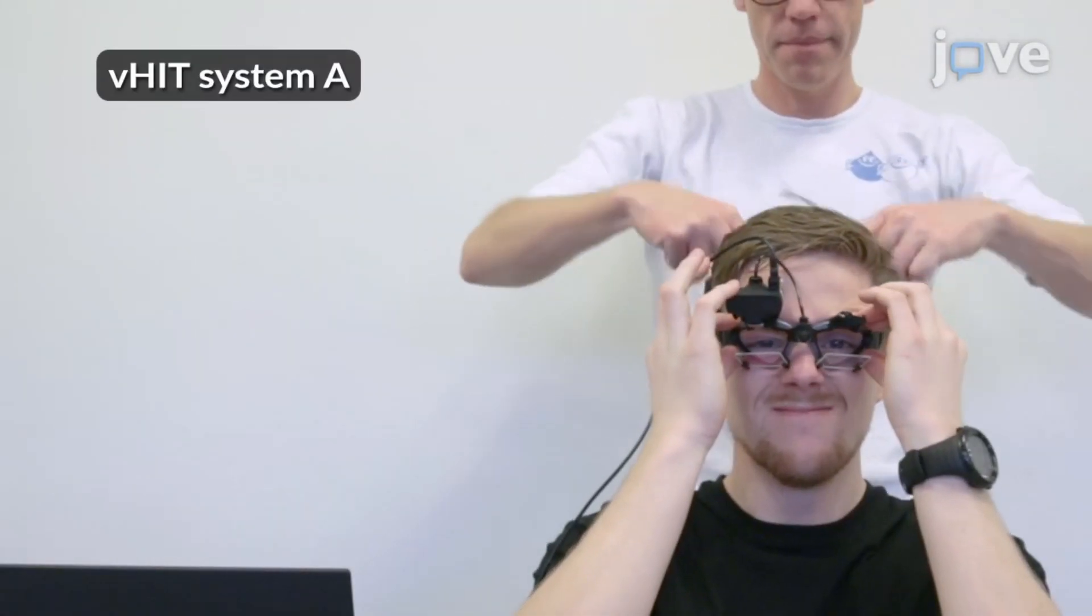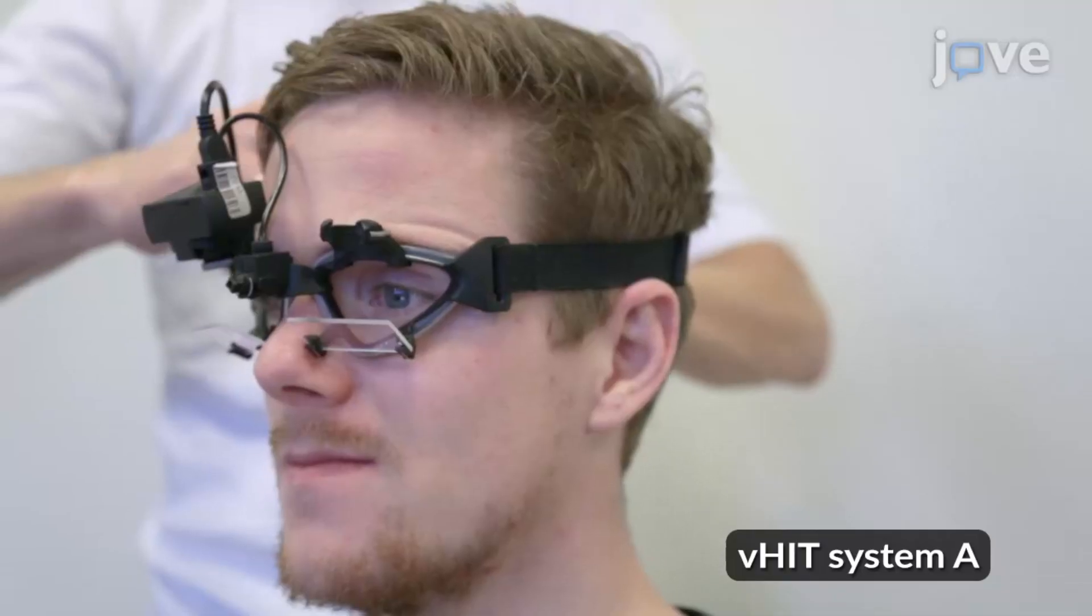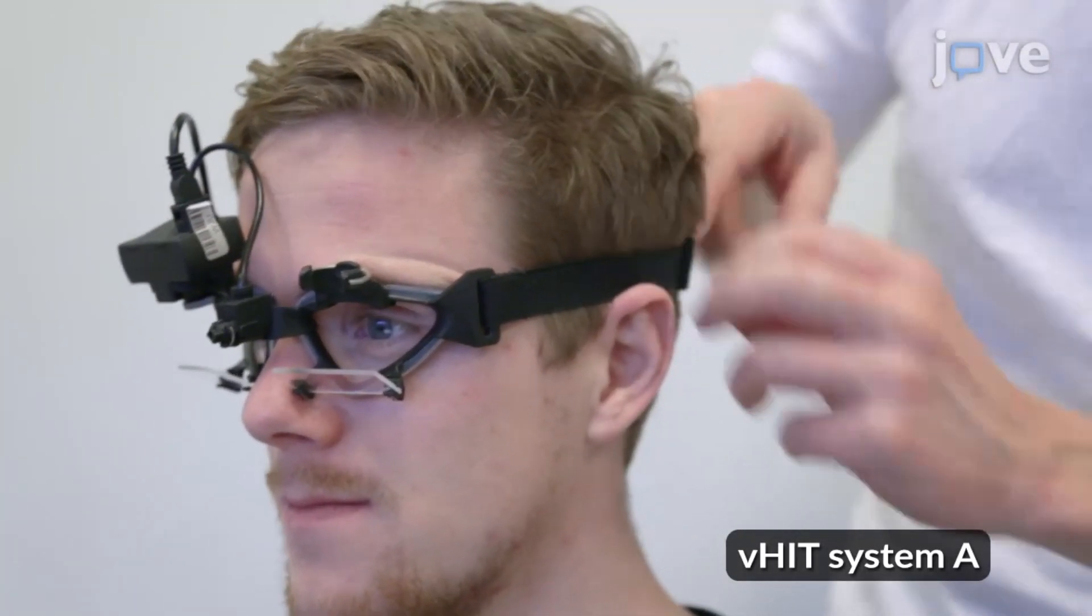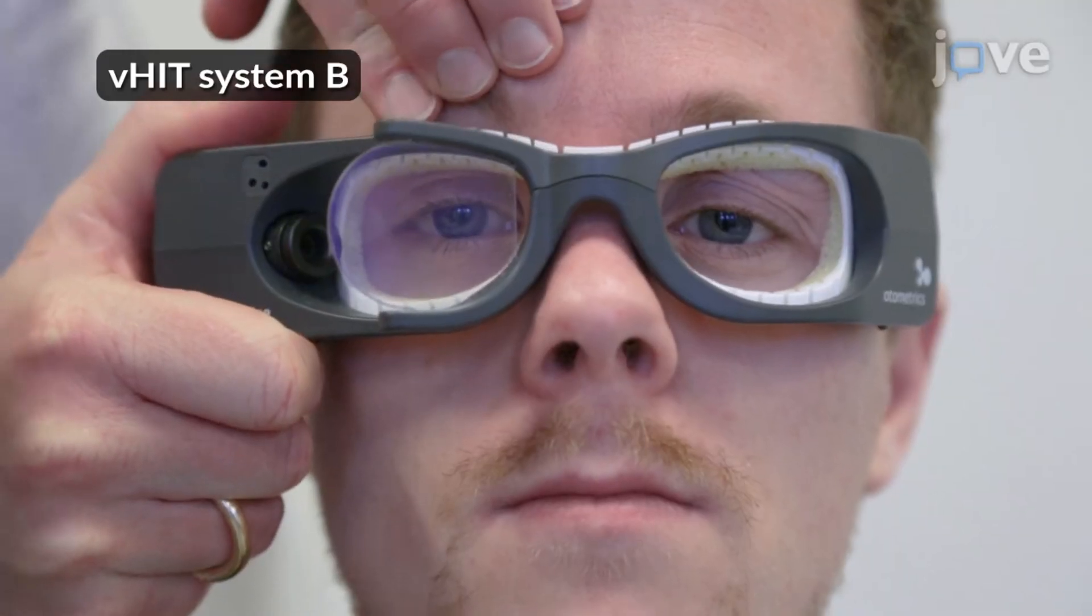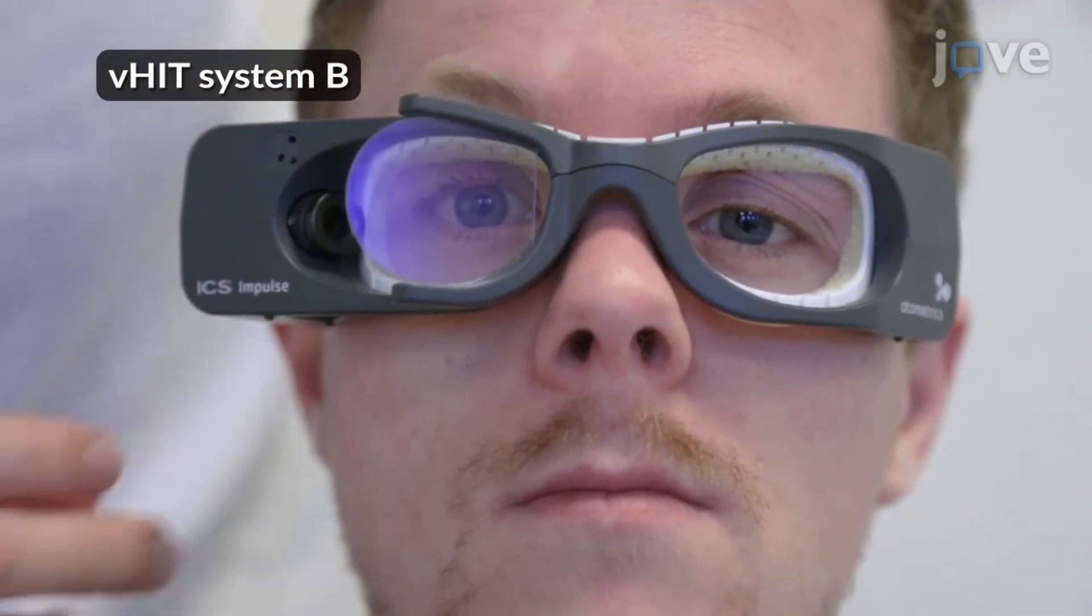Provide goggles and adjust them on the participant's head. Tighten the strap firmly to ensure that goggles will not shift during application of head impulses. Ensure that the eyes are wide open, with eyelids in a position where they do not interfere with pupil detection.